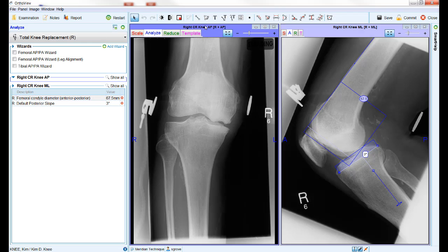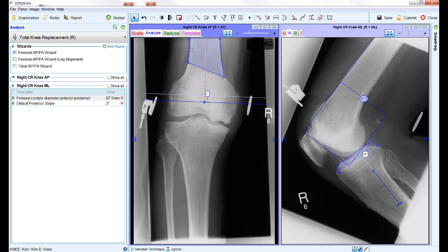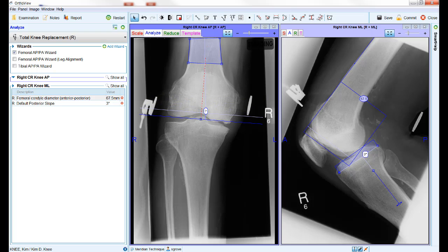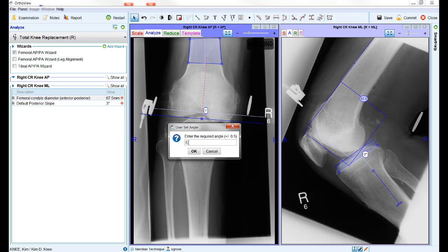On the AP view, starting with the femoral AP/PA wizard, position the rectangular box so that the four corners are on the edges of the femur, picking out the longest straight section of bone available on the image to create the anatomical axis of the femur. Move the horizontal blue line so that it is positioned across the base of the condyles. The angle of this line relative to the anatomical axis — that is the valgus angle — can be adjusted by clicking on the preset number to enter the required value.